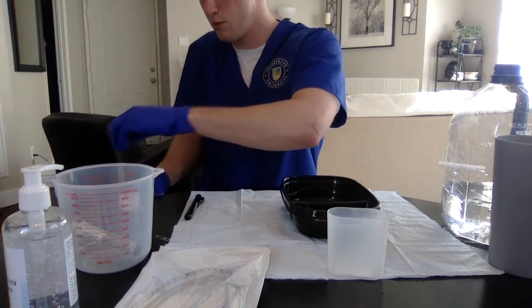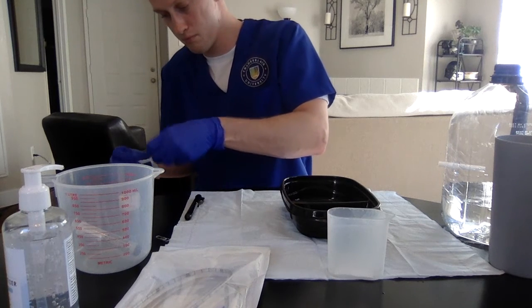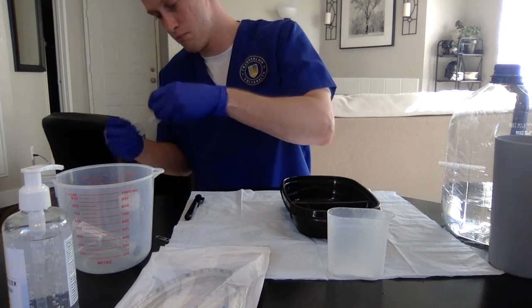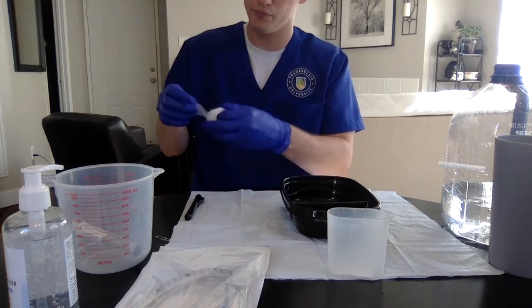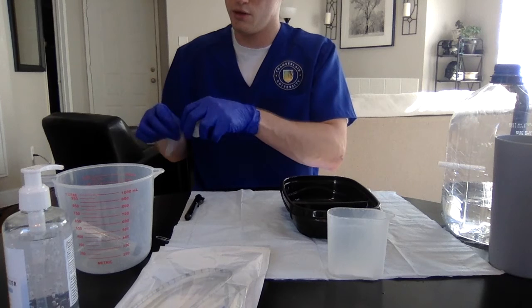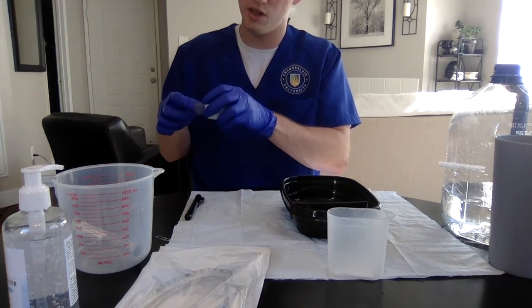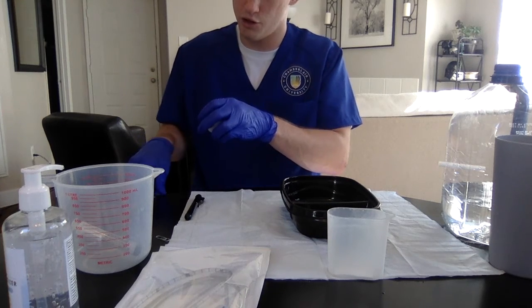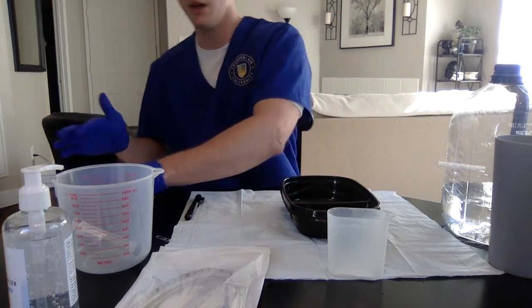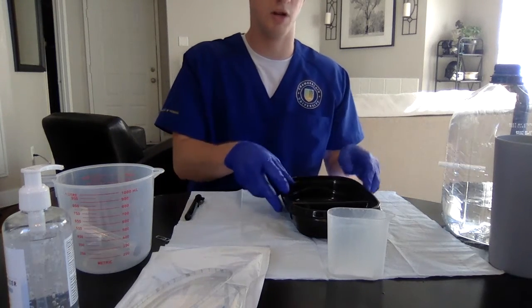Put that, sorry, need a little extra work. I'm going to do another one just in case. I'm also going to do a little piece of tape for our marker for how far we're going to be inserting our tubing here. So now we're done with our tape over there. So we're going to prepare everything else. We have our emesis basin.